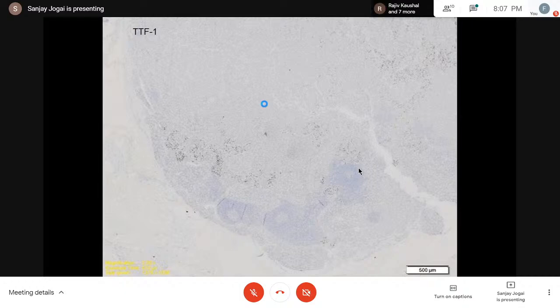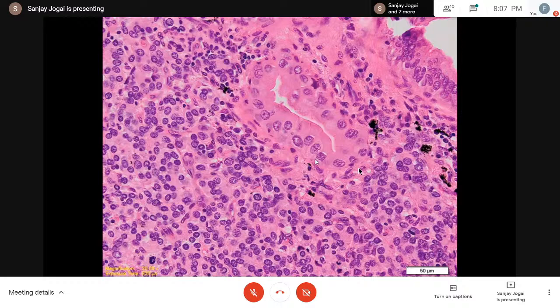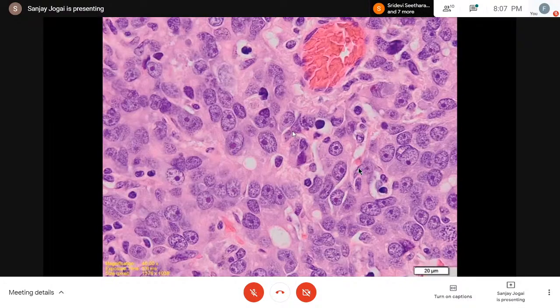And when I went back to the lung and took extra blocks, you have got a lung adenocarcinoma beyond doubt, but bang next to it are these different looking cells. I'll show you on a high power to convince. Look at that. That's an acinus of a lung adenocarcinoma, and these are completely different looking cells, bang next to each other. And look at these cells.